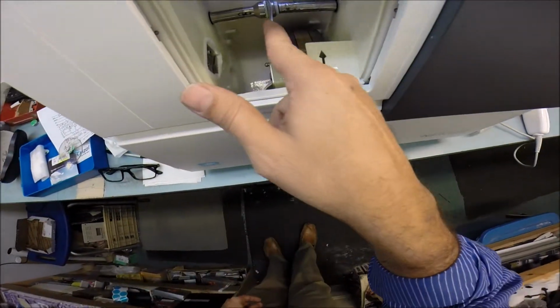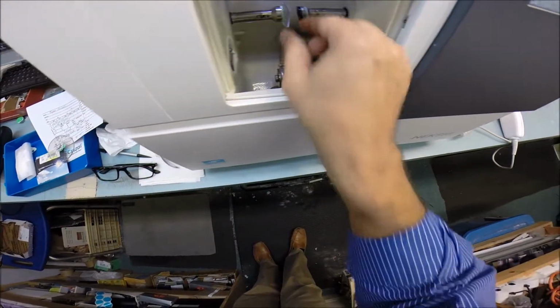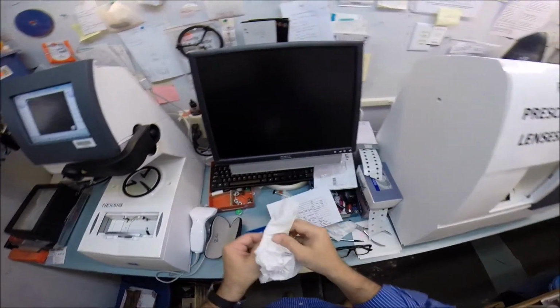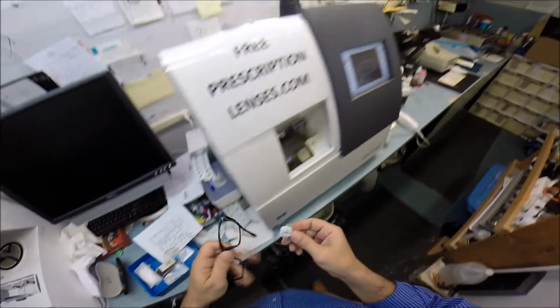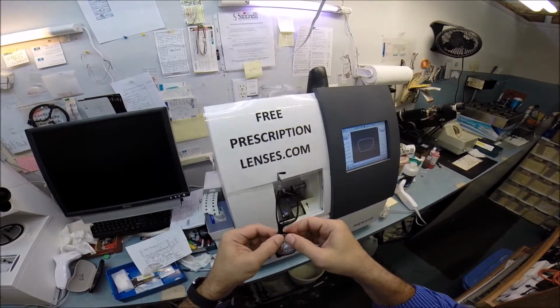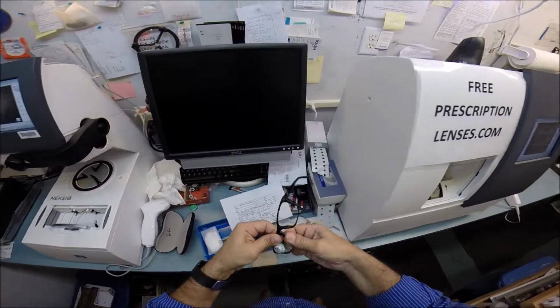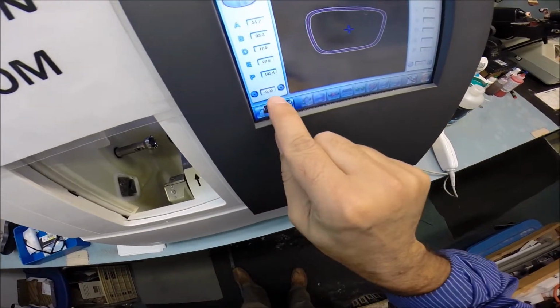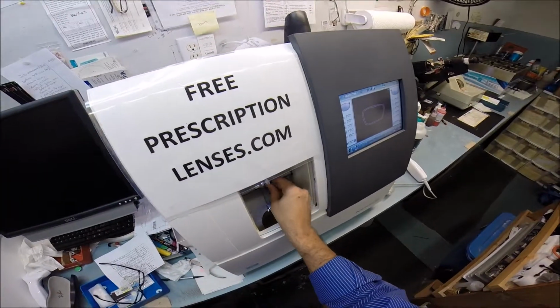Your lens is done. It's still clamped in there, so I'm going to hit this button to open the clamp. Take the magnet out of the chuck. Grab a paper towel and dry your lens off, and we're going to see if it fits in first time. So I'm going to take your right lens, tuck it in at the outside corner first, and then using my thumbs, press down at the nose. There's still a little bit of give, so I'm going to take it back out, and I'm going to take it down 0.5, 0.10. That is 1/10 of a millimeter.